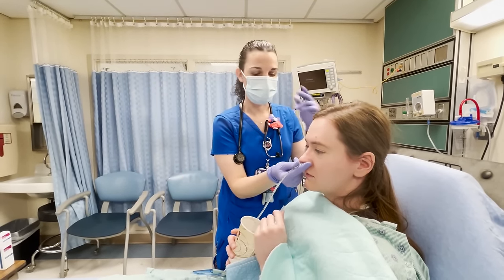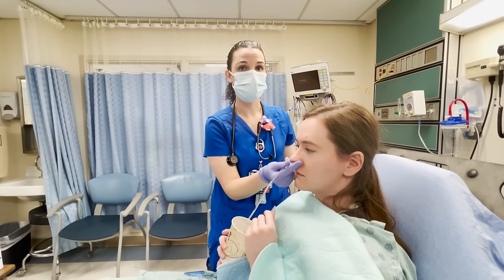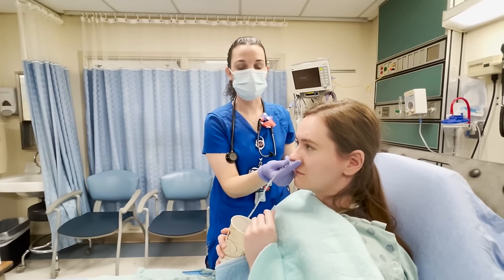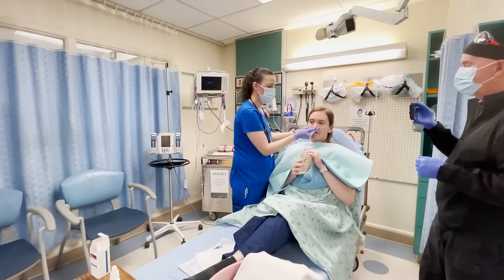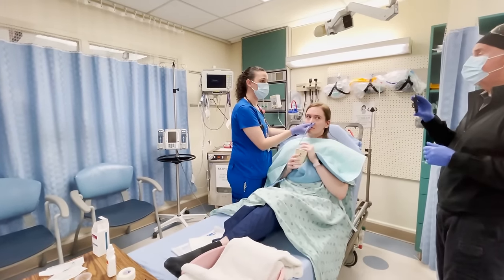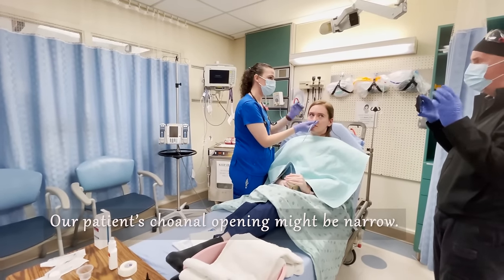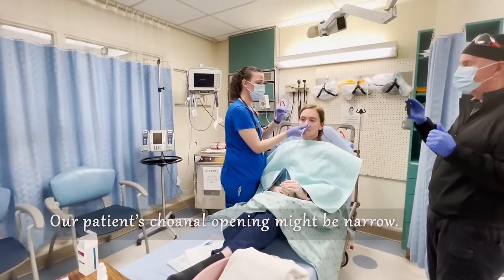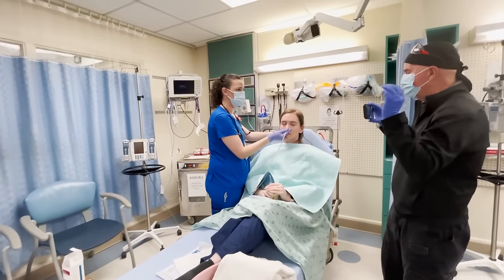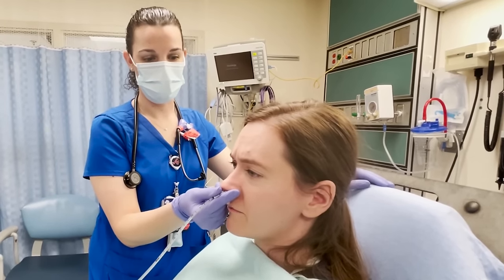We went through the notch on the left side and used a 14 French — we had the option to go with a 12 but chose the 14 for a more valid adult demonstration. Anatomically, there may have been a slight narrowing back there, but once past it things went smoothly. As it was moving down while you were swallowing, were you feeling much discomfort? No, not much at all.